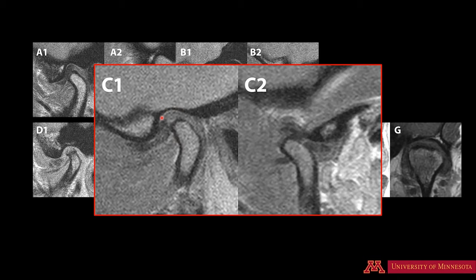In this case, the condylar head, articular fossa, eminence. This is the posterior band of the disc, central zone, anterior band — we'll call this anteriorly displaced disc. The same patient, when the mouth opens, the central zone is in contact with the condylar head. So this is anteriorly displaced disc with reduction.